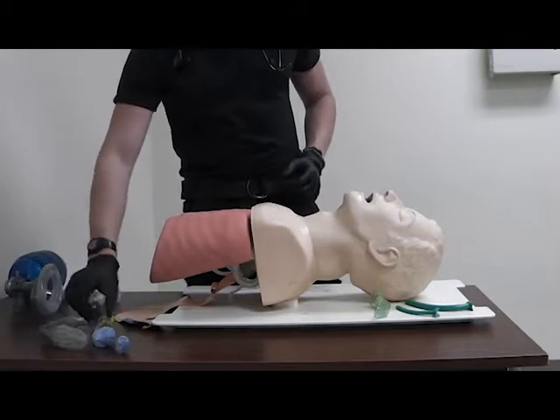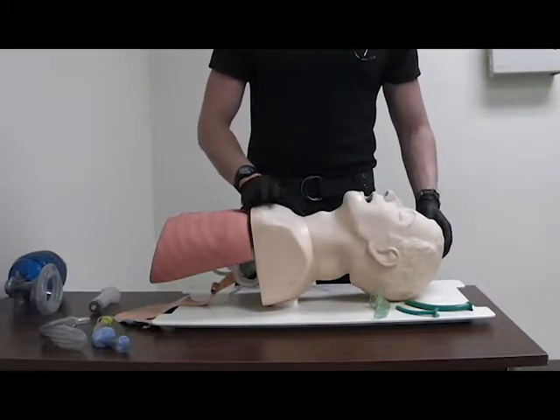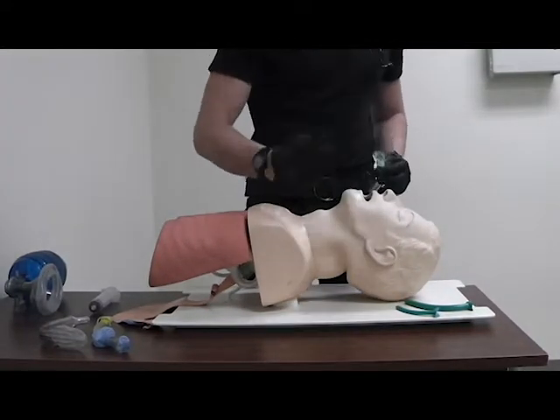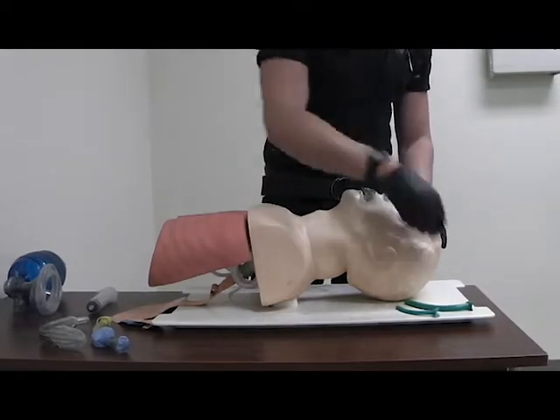Before you start using the KING, you want to check to see if the patient is apneic, and you want to position their airway and insert an OPA and an NPA on two sides.